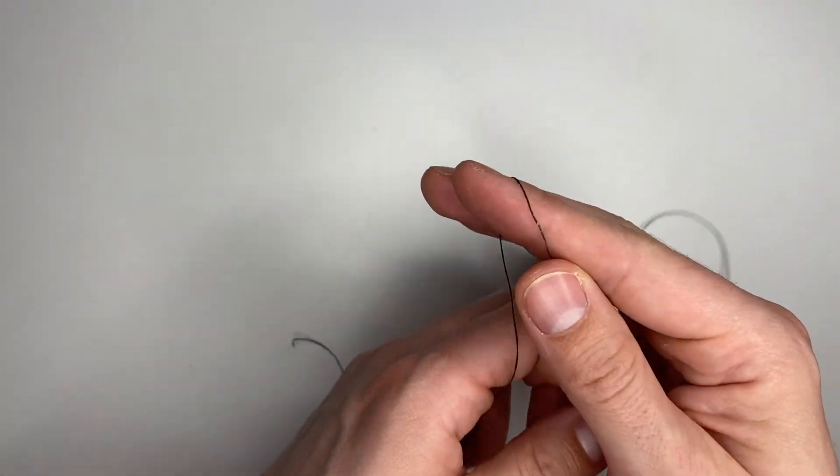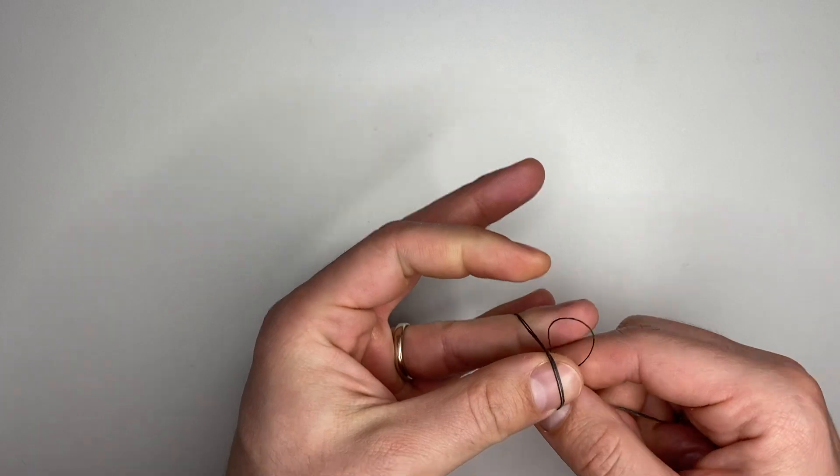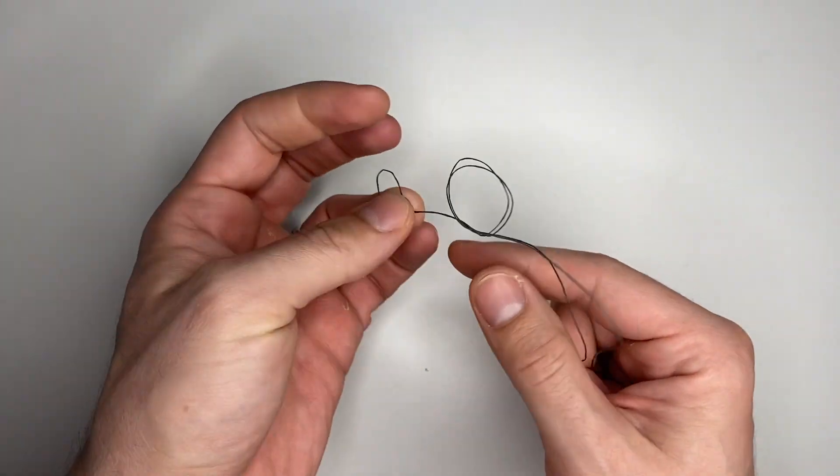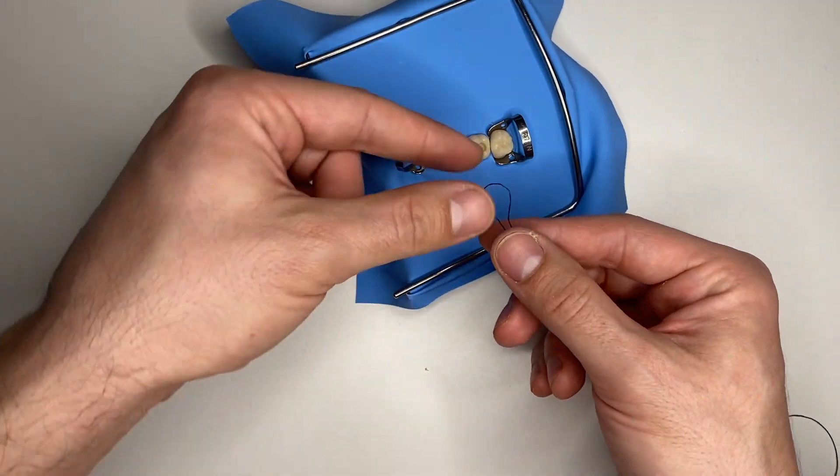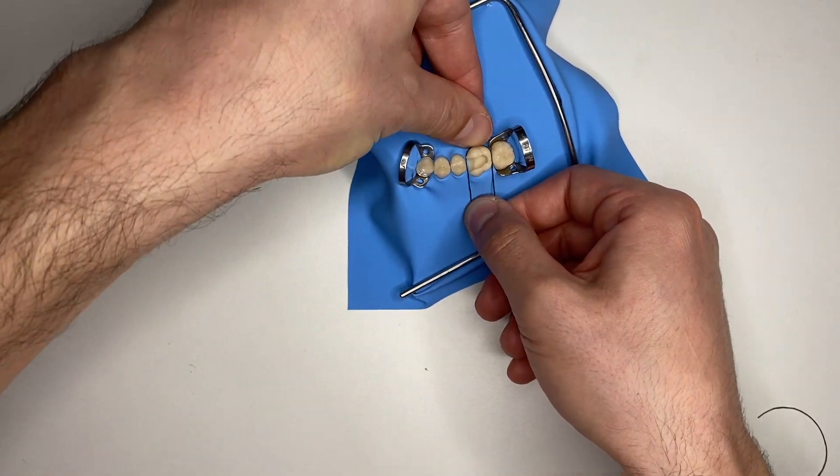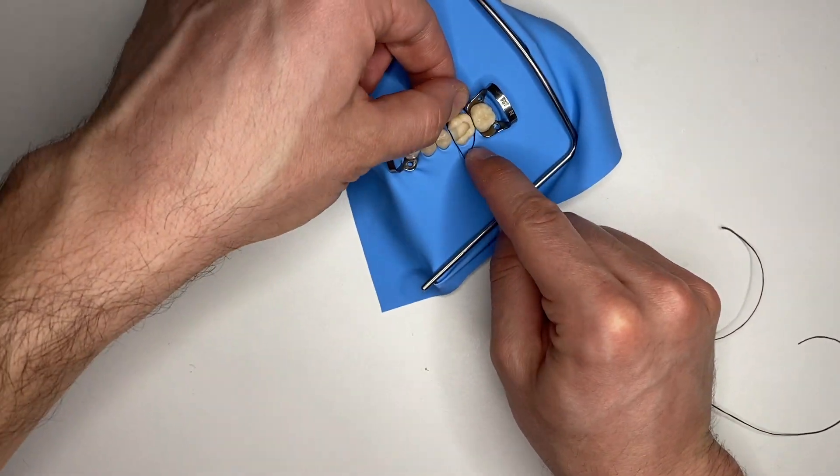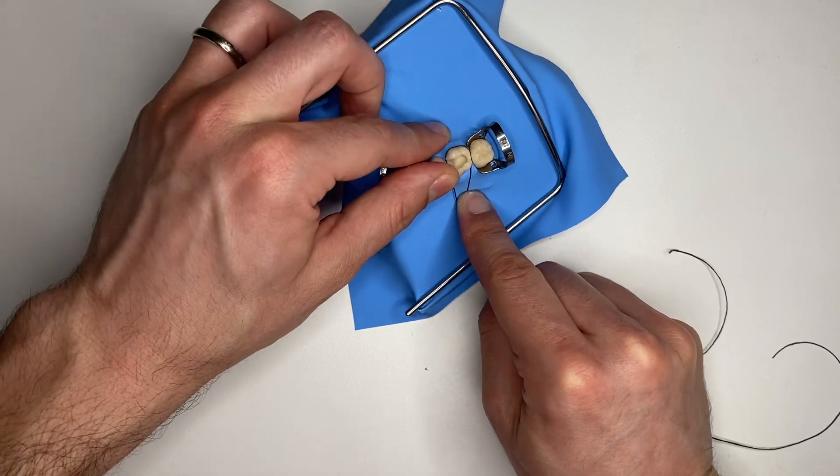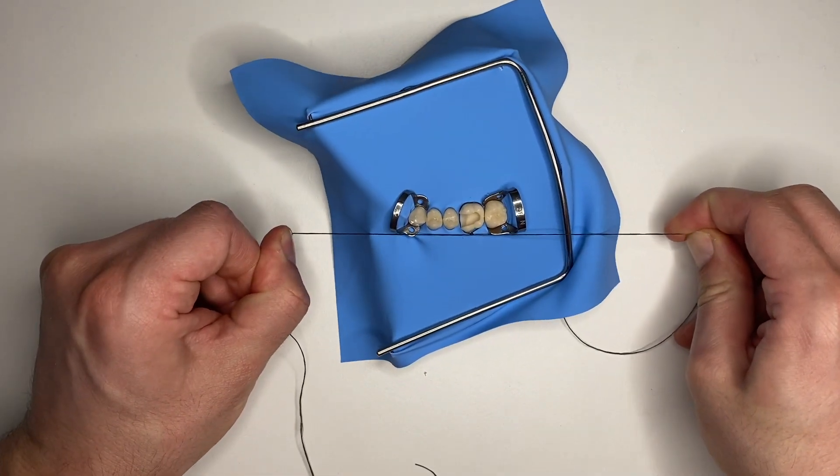These are very comfortable to use if you have an assistant, because your assistant will be able to fix the end of your ligature on the palatal aspect of your tooth using a metal probe, and you will be able to use both of your hands to tighten the bow and keep it where you want it.